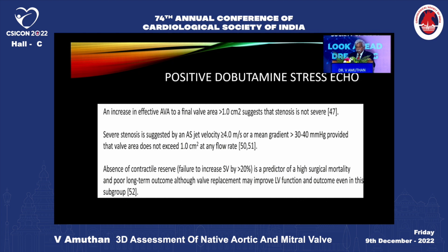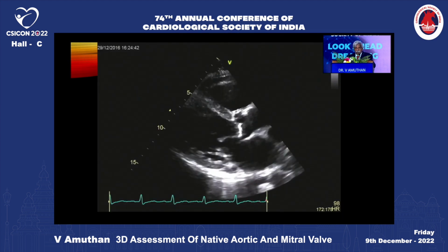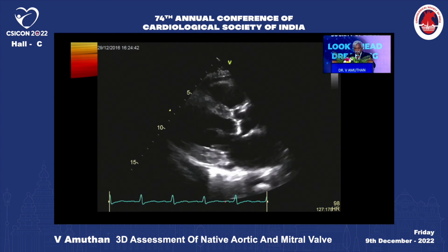In a positive dobutamine stress echo, there is an increase in effective aortic valve area to a final aortic valve area of more than 1, which suggests stenosis is not severe. Severe stenosis is suggested by an AS jet velocity which increases, as was shown in one of the cases in the morning session. Absence of contractile reserve is a predictor of high surgical mortality and poor long-term outcome. So I will elaborate on a case where I used treadmill exercise test, not the dobutamine test.